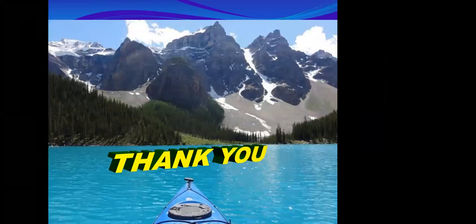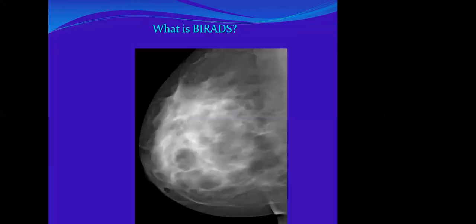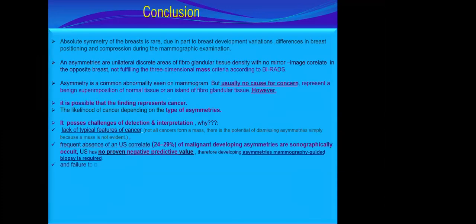Any questions? Assalamu alaikum, Dr. Rabab. Wa alaikum assalam. I am Heidi. Regarding the slide before the conclusion, could it be a complicated cyst on ultrasound? This one? No, this is soft tissue. It is a soft tissue, and it was a biopsy-proven fibroadenoma. Oh, okay, thank you.